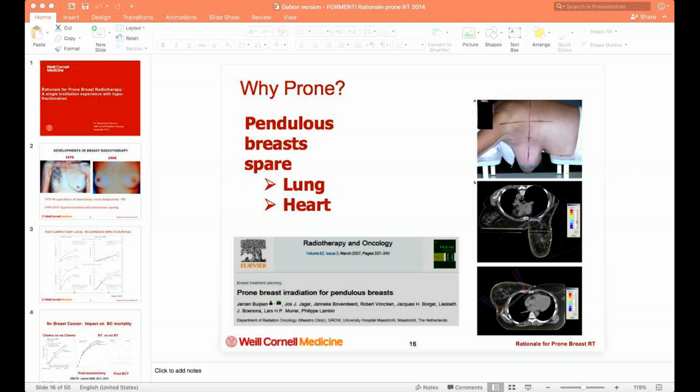You should do the additional portion of the scar sequentially. If you have an unmatch, you should feather the field.